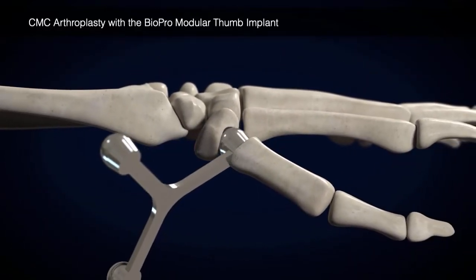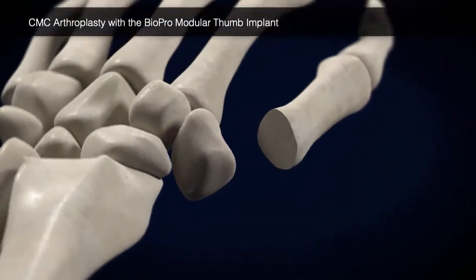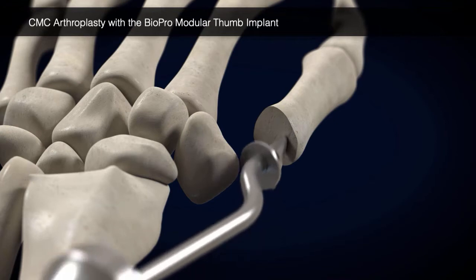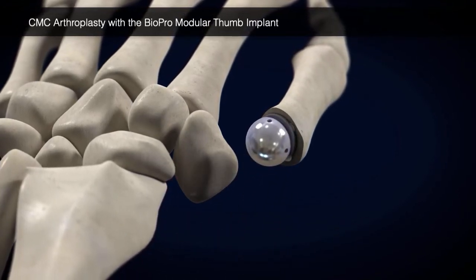Insert the head sizer guide to determine stability and proper joint tension. Broach the metacarpal with sequentially sized broaches, then insert the appropriately sized trial stem and head.